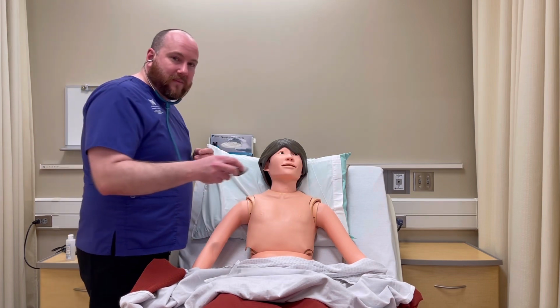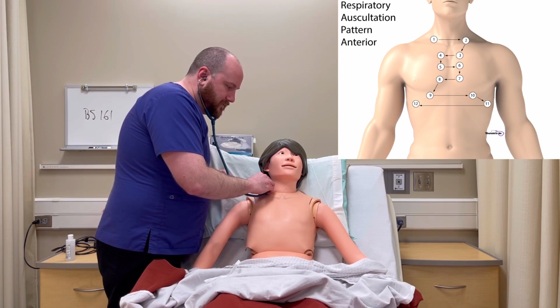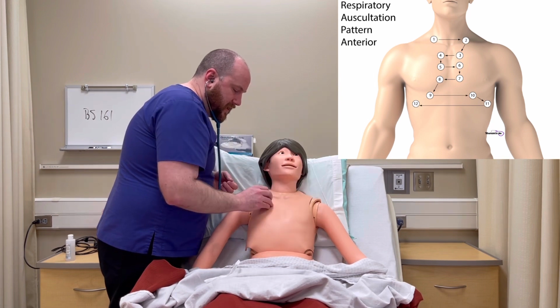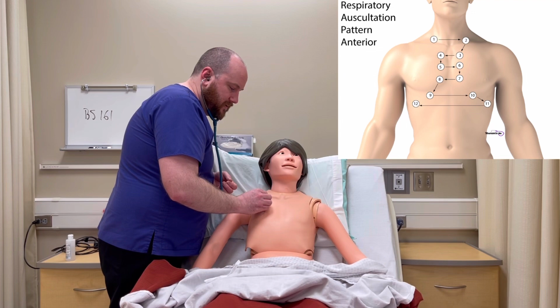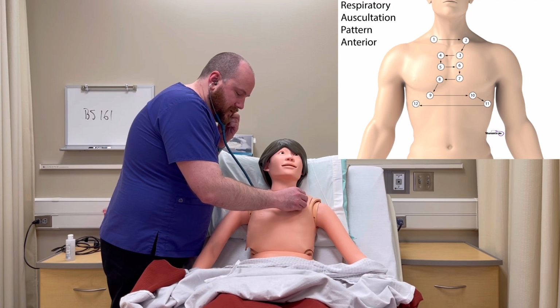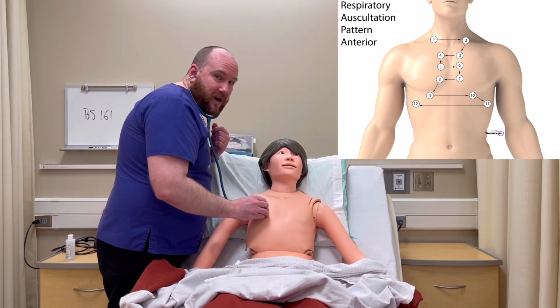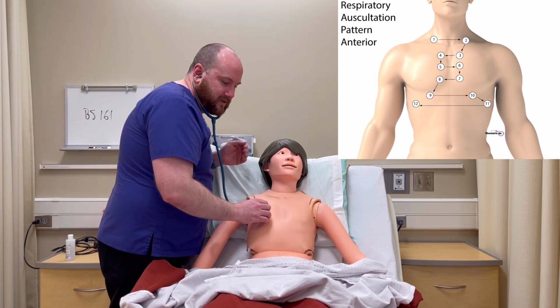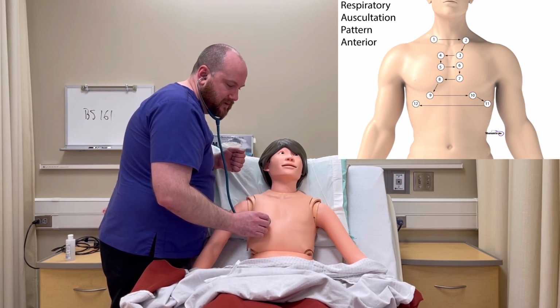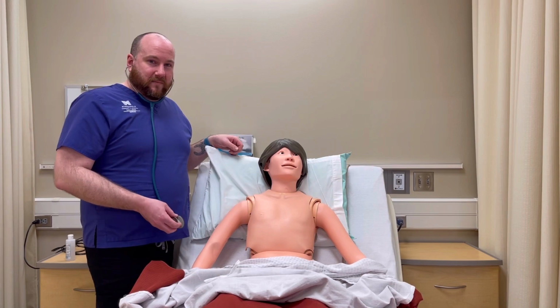So then we start by listening above the clavicle on each side for at least one full breath. And then below the clavicle for one full breath. And then we move down an inch each time. And we're comparing each lung to the other in each section. Then we repeat on the back.